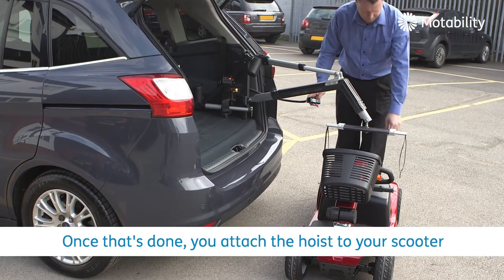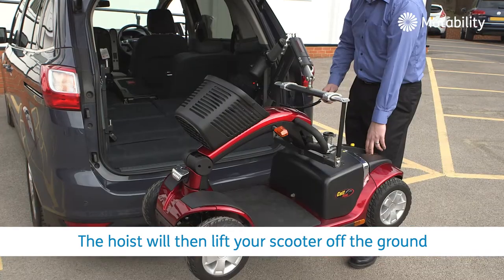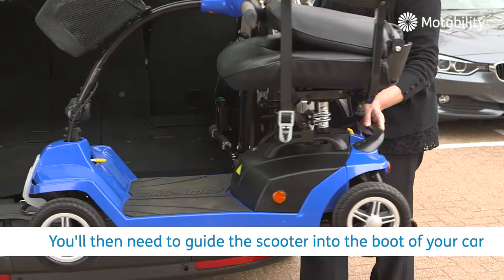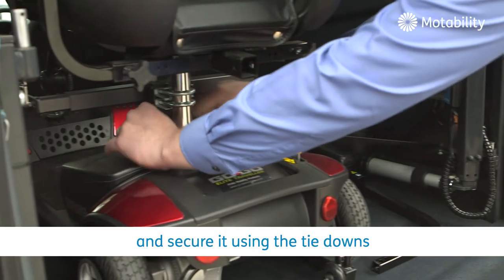Once that's done, you attach the hoist to your scooter. The hoist will then lift your scooter off the ground until it's level with your boot. You'll then need to guide the scooter into the boot of your car and secure it using the tie-downs.